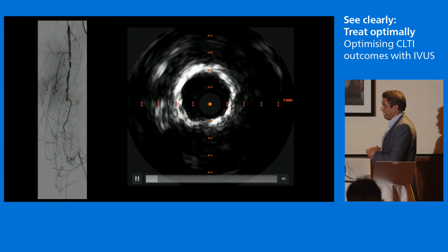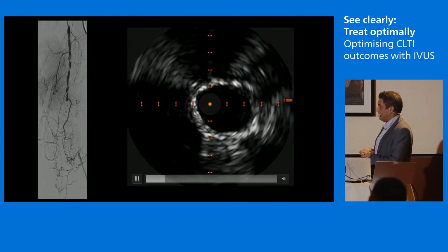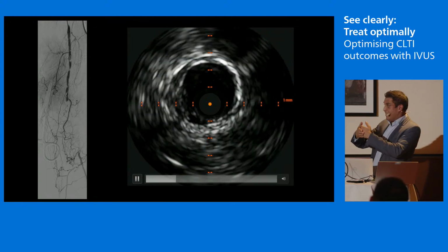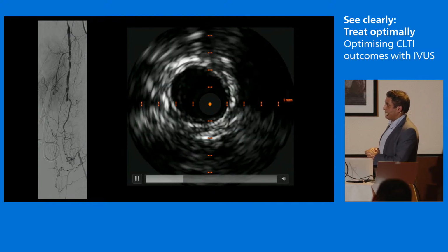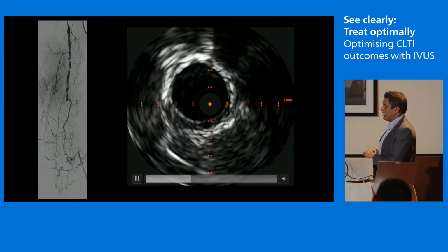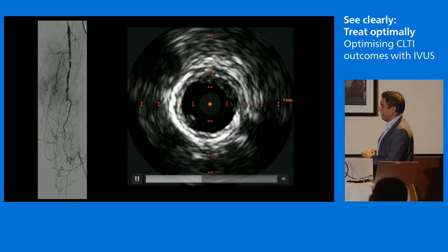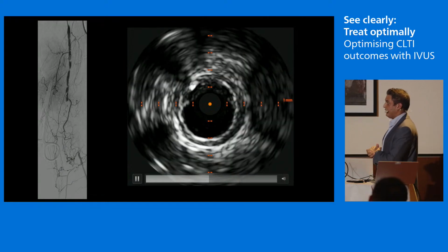Okay, so this is the IVUS catheter in a popliteal artery, as you see in the pullback here. You see that this is heavy intimal calcification. You almost lose the intima and media because the whole vessel is calcified. So we're in the lumen throughout, as you can see here. And there are clear areas of eccentric calcified plaque, and I'll try and pause it at one point. There's some soft plaque at the top. Okay, that's clearly some soft plaque.